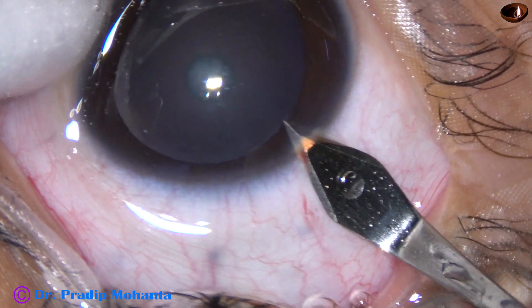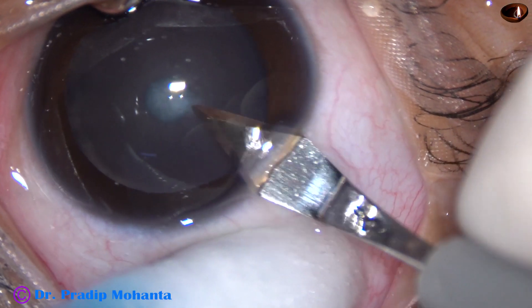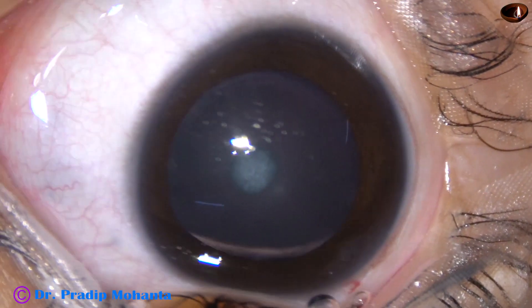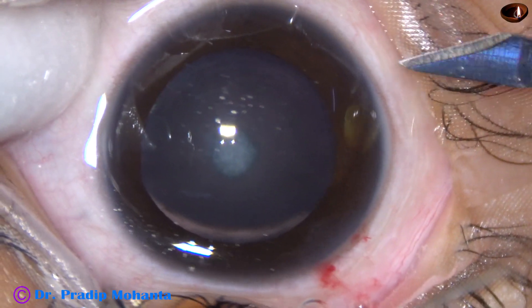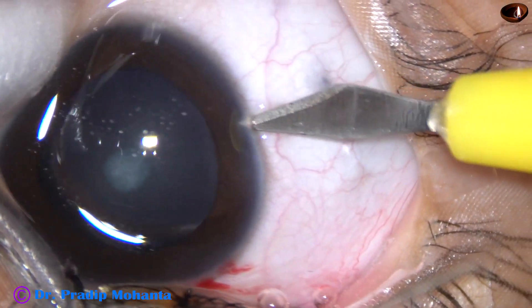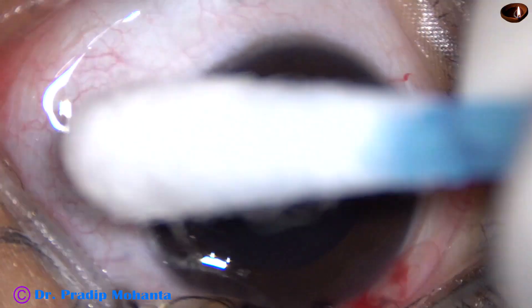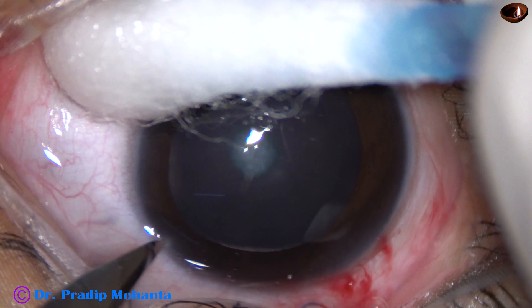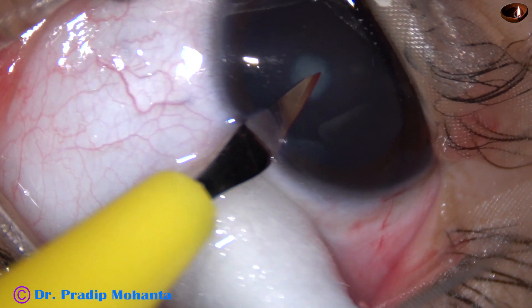This is the main incision on the posterior aspect of the limbus. You can see oozing of blood from the lips of the wound. This is a side port on the right side of the main incision, and this is another side port on the left side of the main incision.